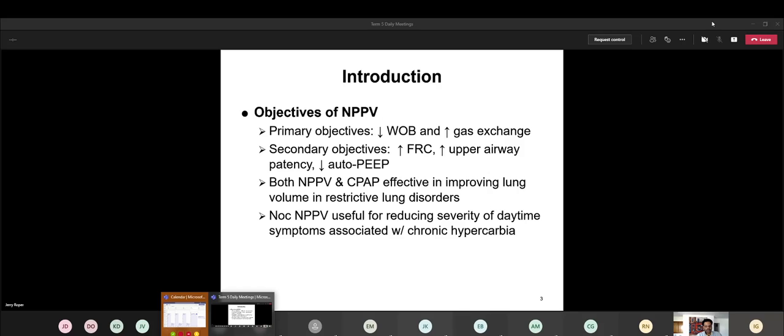what if you got someone who has some kind of chronic lung issue, and at nighttime they definitely are going to need some help with ventilation. And we all breathe more shallow at nighttime when we're sleeping. But for someone with some kind of lung disorder, chronic lung disease, it's even more so. So then that's when NPPV would win. So you don't want to think CPAP, because again, CPAP is not ventilating. That's why there's no V in CPAP, but there is a V in NPPV.